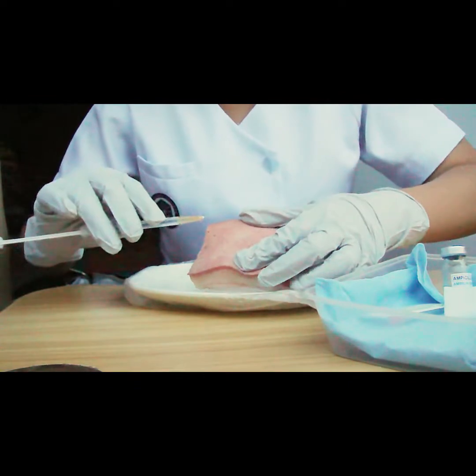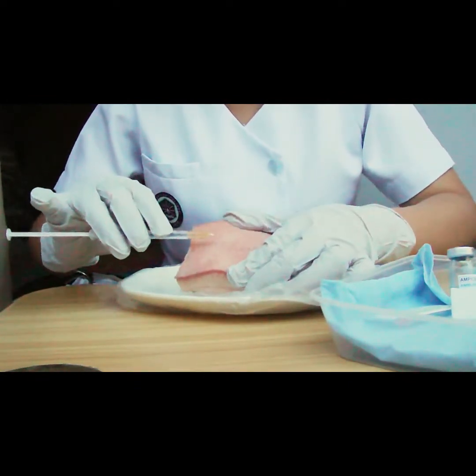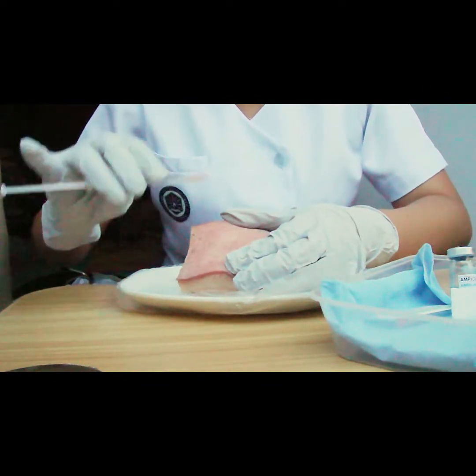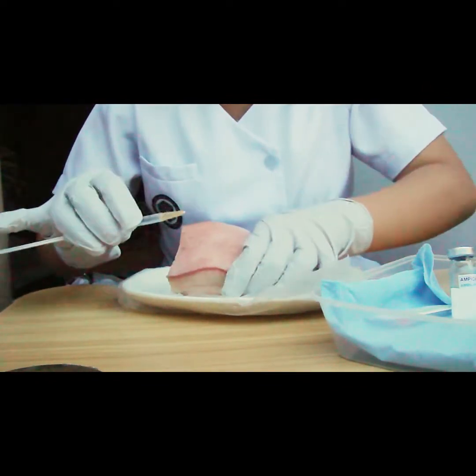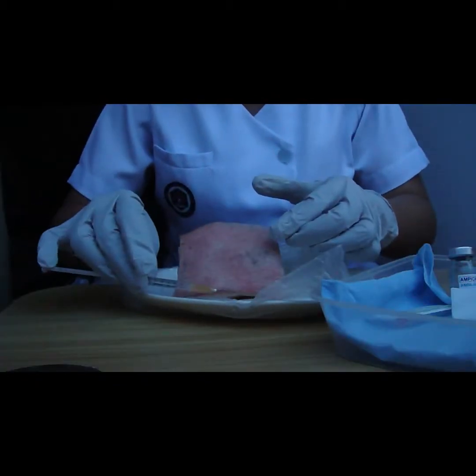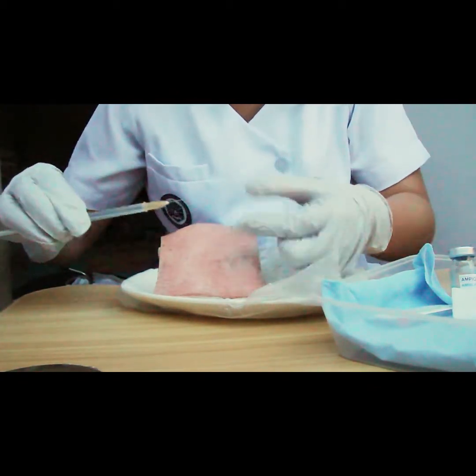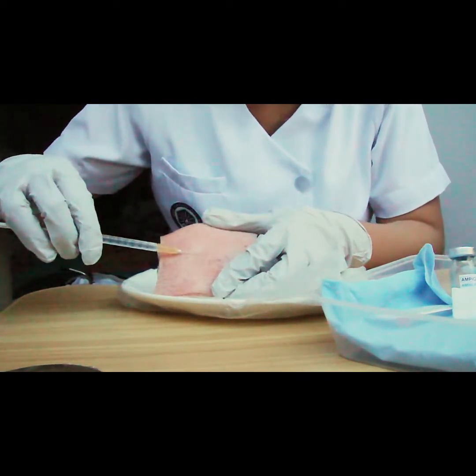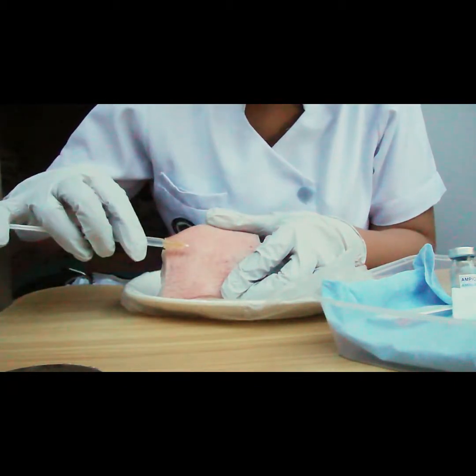Kailangan natin siyang i-stretch. Okay, ganyan. Galing siya sa freezer, kaya medyo matigas siya. Hindi ko siya ma-pinch, kasi kailangan pala bevel up.